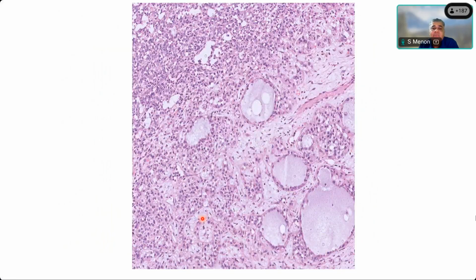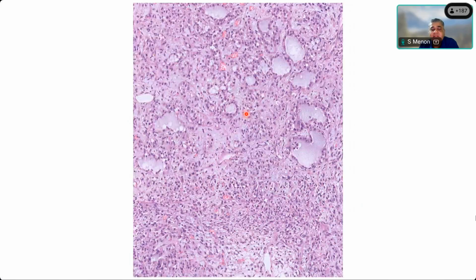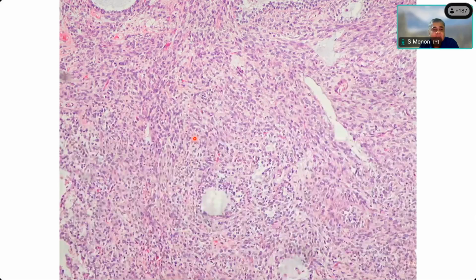This is a picture from juvenile granulosa. Again, a little round and blue-looking tumor, but there is a lot of pink cytoplasm. Most juvenile granulosa tumors will have these kinds of cysts filled with mucinous or myxoid material. That's a giveaway and generally a good feature to pick up in juvenile granulosa cell tumors. But again, the age is important.